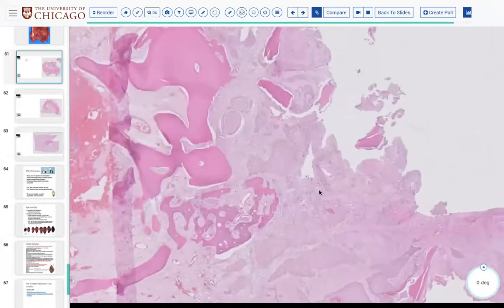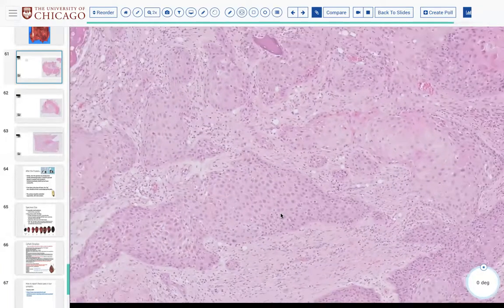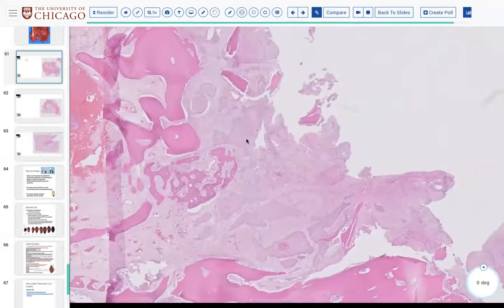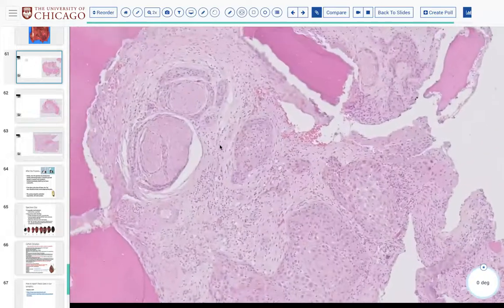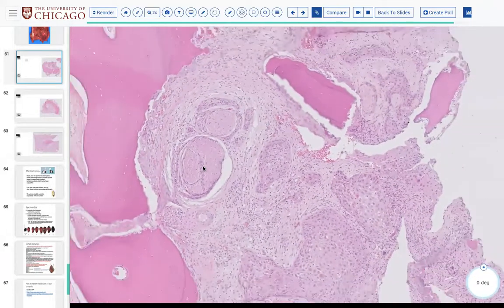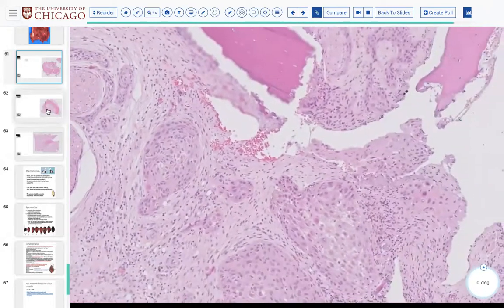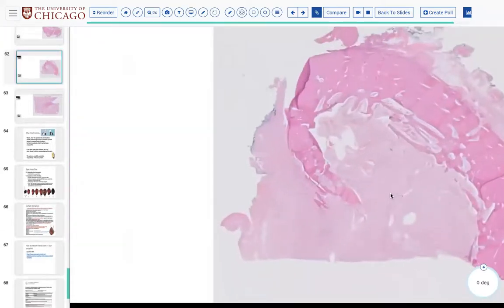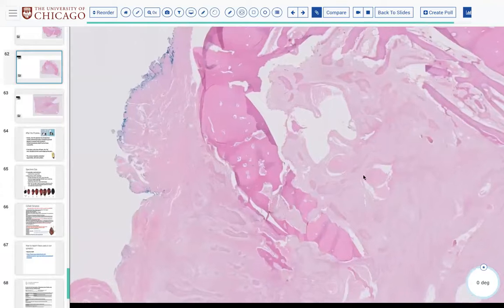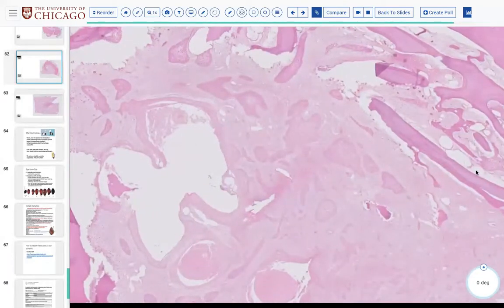Oh yeah, there it is. So this is that en face margin that we took from the main specimen that corresponds to that stuff that she chunked out and sent that was positive. And look, it's got even gorgeous perineural invasion there. So just a good educational lesson for us in this case.